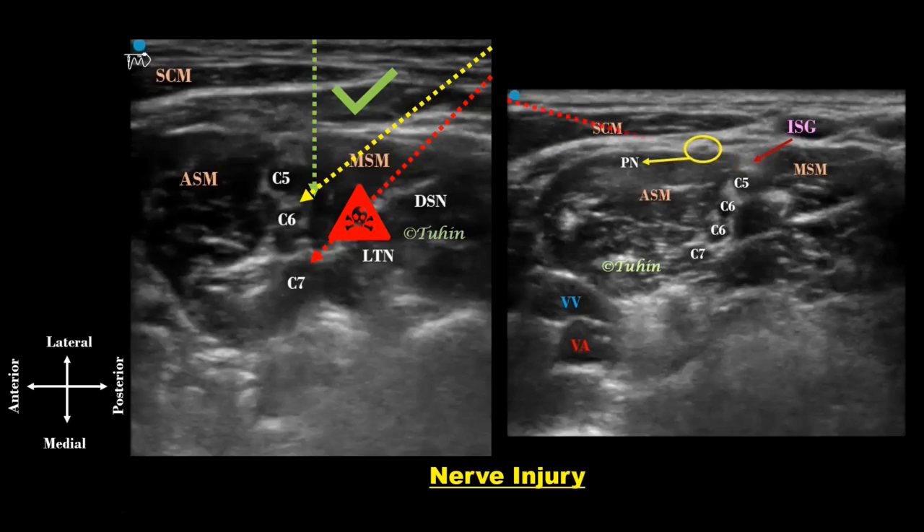Medial-to-lateral in-plane needling is also avoided because the phrenic nerve may be encountered here. It appears as a hypoechoic small structure with a hyperechoic border over the belly of the anterior scalene muscle. Hence, the out-of-plane approach may provide a safer route for the interscalene brachial plexus block.